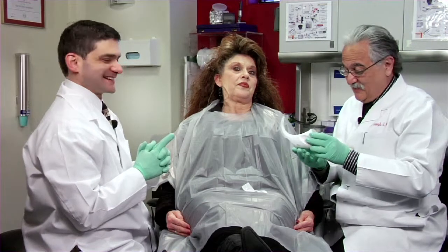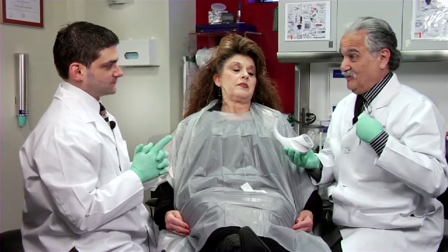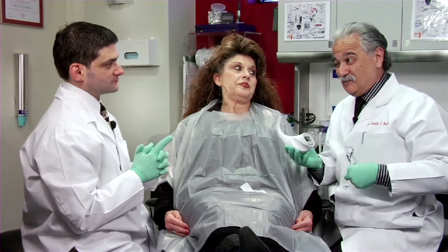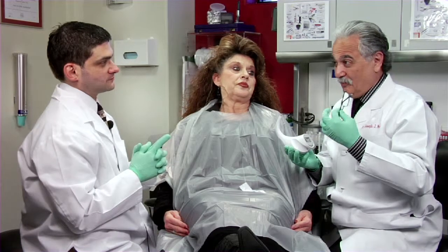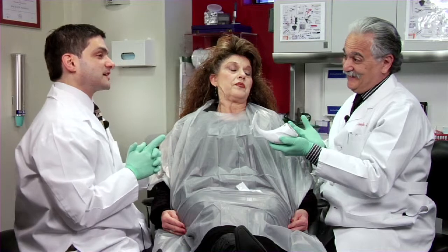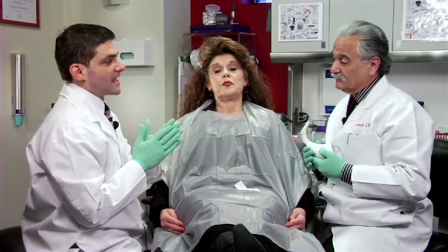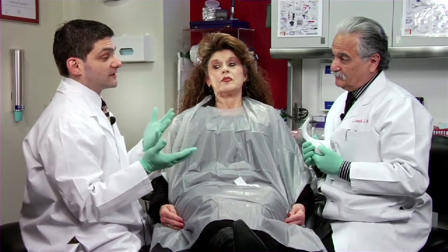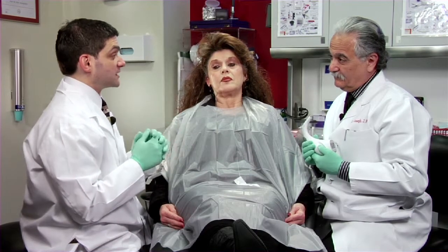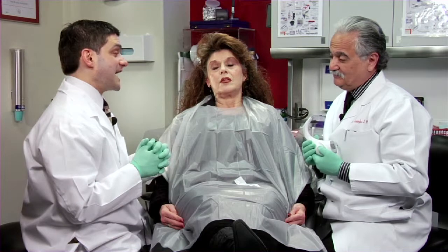There's another aspect too: patients with existing restorations — especially removable — who say 'I want these teeth just like my old ones.' Many times if they weren't porcelain teeth they will wear and the shading has changed. You just go ahead and take the shades and say 'here's what your existing teeth currently look like.' With denture teeth and the available modes it'll come close but it won't be exact — but just like with the crown, you can say we can get close or we can get it exact. That's another great communication tool.